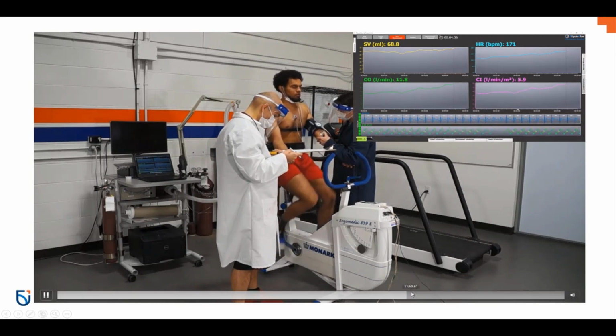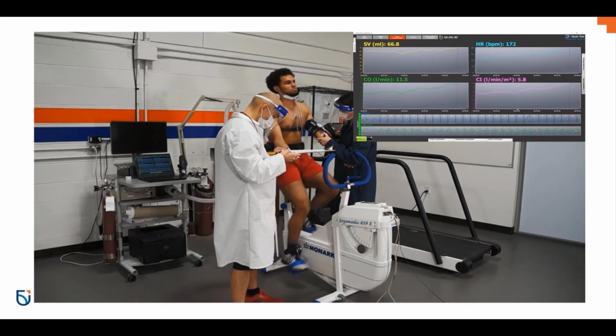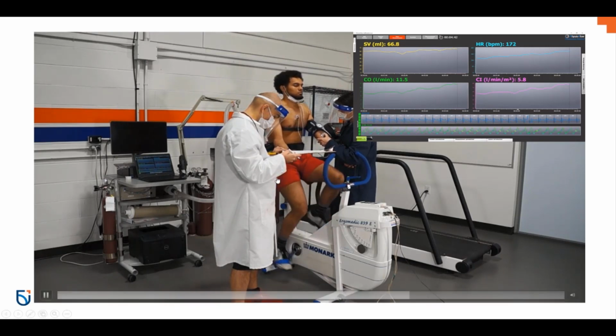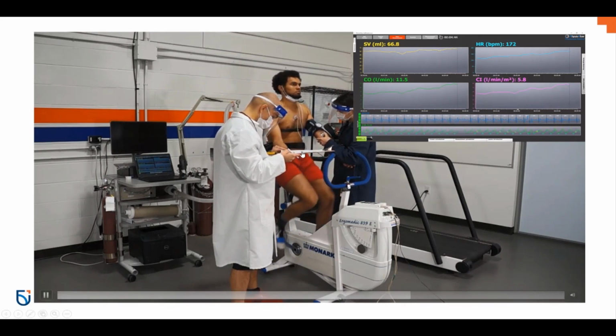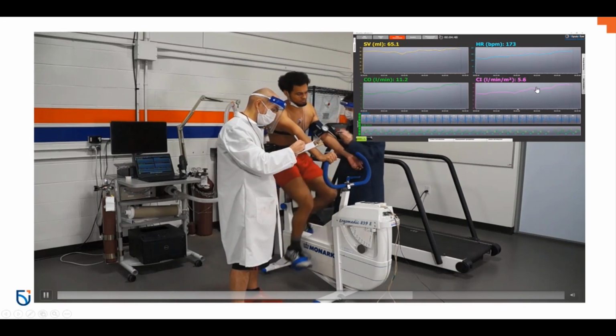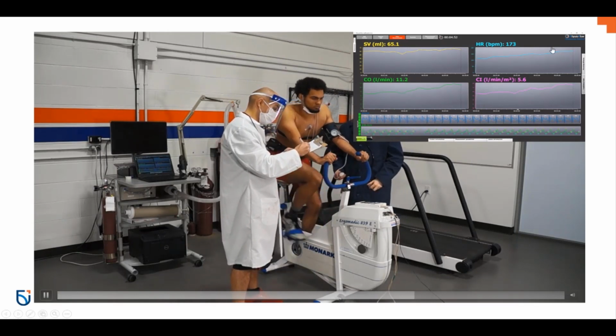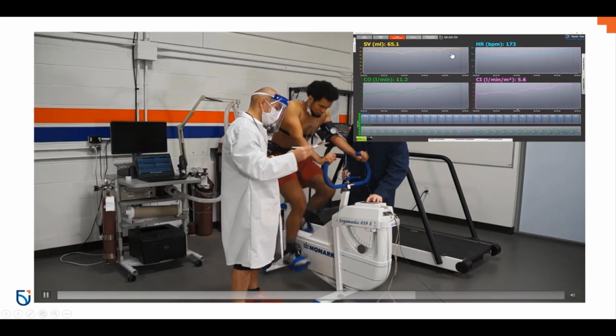At the end of our first workload stage here, now our second overall stage, but our first workload stage, Nick and I are going to take our measurements: our heart rate, RPE, and blood pressure. We can see that our heart rate's up to 172, and cardiac output is rising almost identically to this heart rate graph. No real change in stroke volume yet.